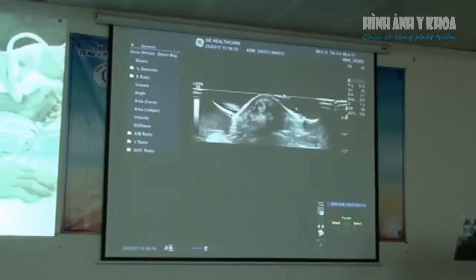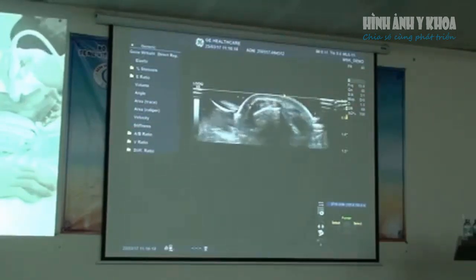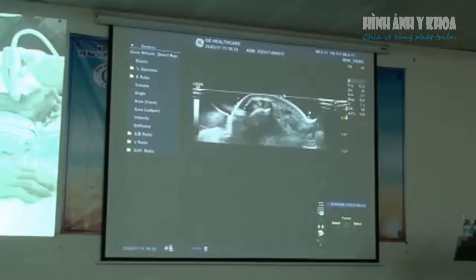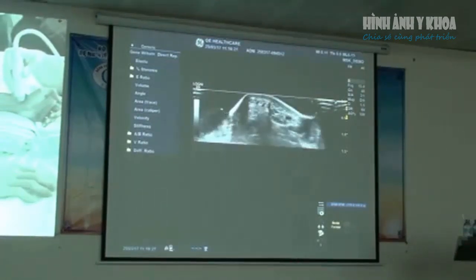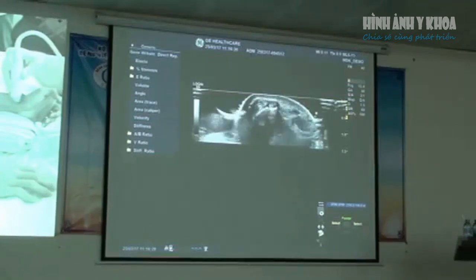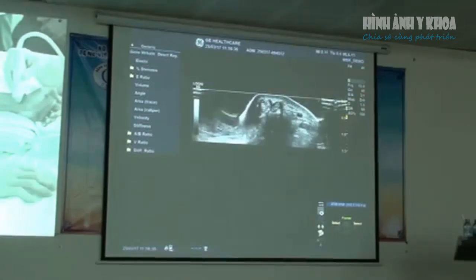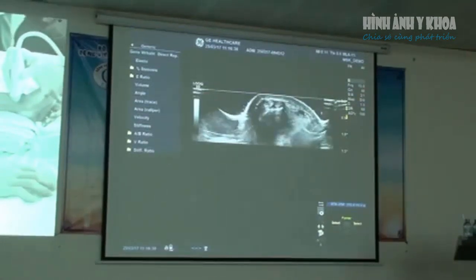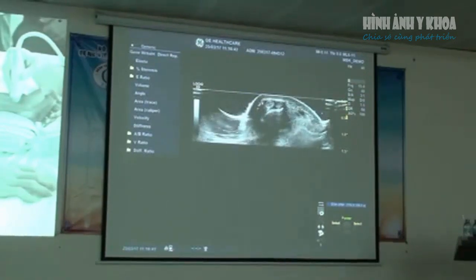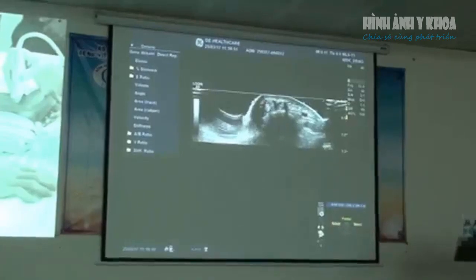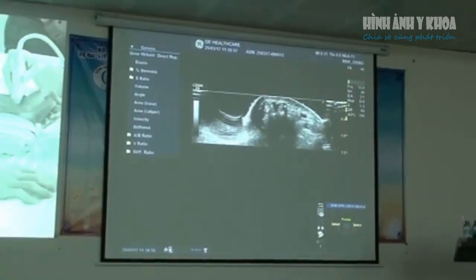When we're doing wrist ultrasound, I use a lot more gel and you need to use very light probe pressure. You can see here, this is where you get that De Quervain's tenosynovitis. You can see there's one sheath there and another sheath just here. It would be important if you're doing a steroid injection for De Quervain's — you need to put steroid in this sheath and also into this sheath.